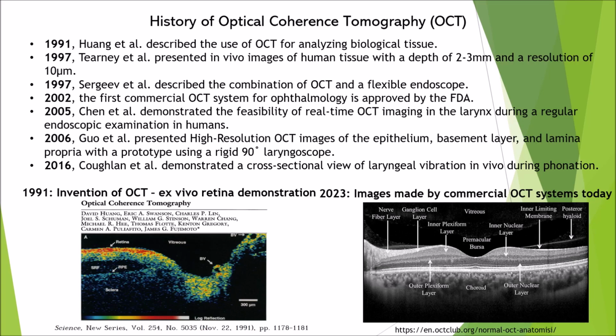In the left picture below, you see the first representation of the eye background, and the right picture, the diagnostic possibilities today. As for laryngology, Brian Wong and his co-workers made a study in 2005 based on a placement of a probe just near the vocal folds and showed that the method can be used in laryngology. Since then, there has been a huge development, and we will present some of the latest studies made especially by his crew and a group in Germany.